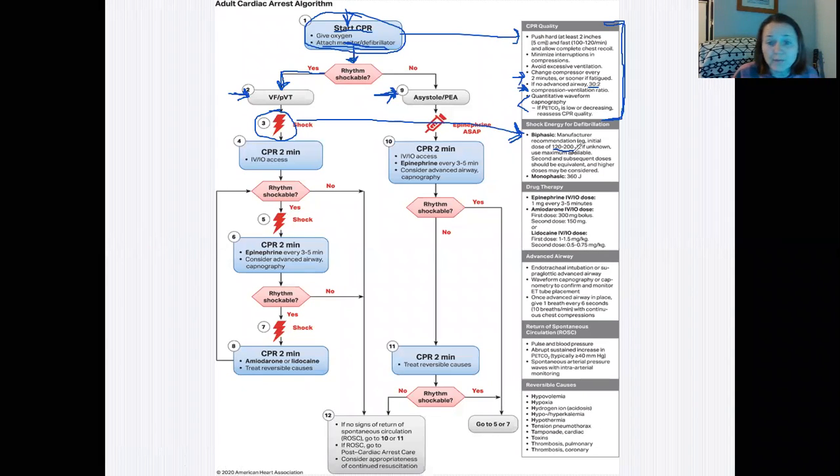And if you don't know if it's biphasic or monophasic, you're going to go ahead and crank it up, because you don't know. If it's monophasic, we're going to do 360 always, basically. If you are using a biphasic defibrillator, the second and subsequent doses should be equivalent or higher. Meaning if you started with 120, you shocked them at 120, then the next time you shock them, you're at 200. The next time you shock them, you're at 360. You're going up every time, or at least equal. But typically you're going to go up until you get to the maximum, and then you're going to stay there.